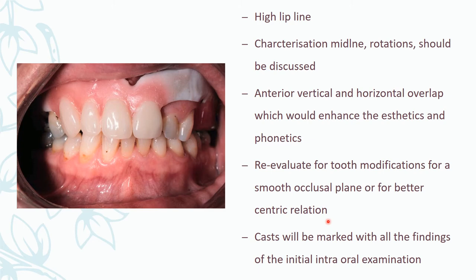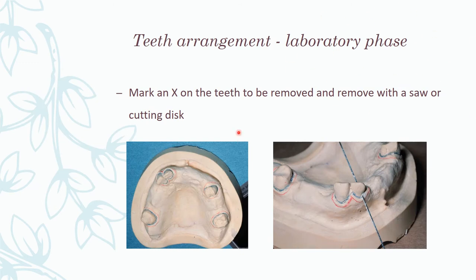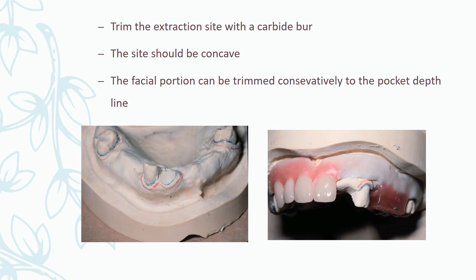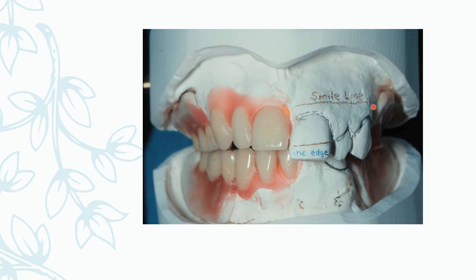The cast will be marked with all findings of the initial intraoral examination. For the lab phase: mark an X on the tooth to be removed, and with a saw or cutting disc trim it off, maintaining a concave surface. Trim the extraction site with a carbide bur and maintain a proper concave ridge. The facial portion can be trimmed conservatively to the pocket depth line.